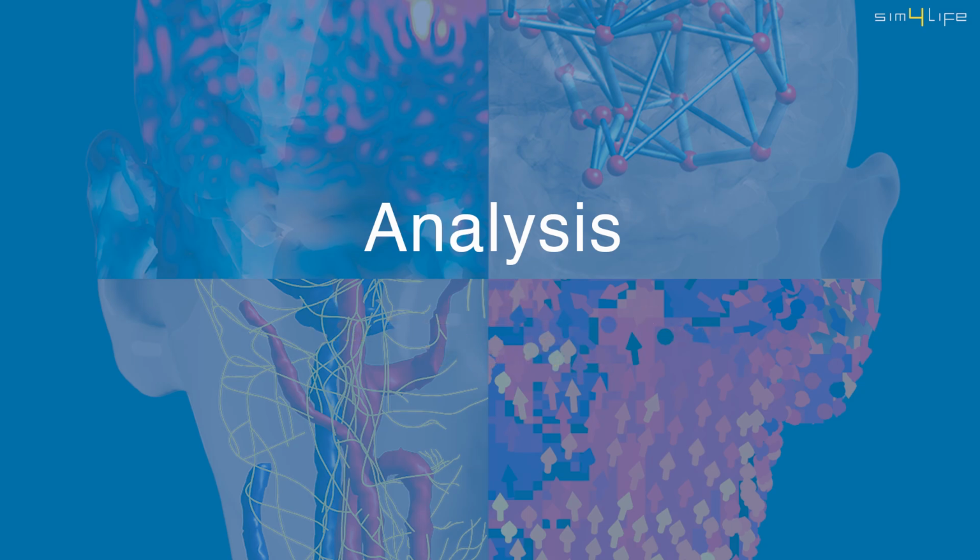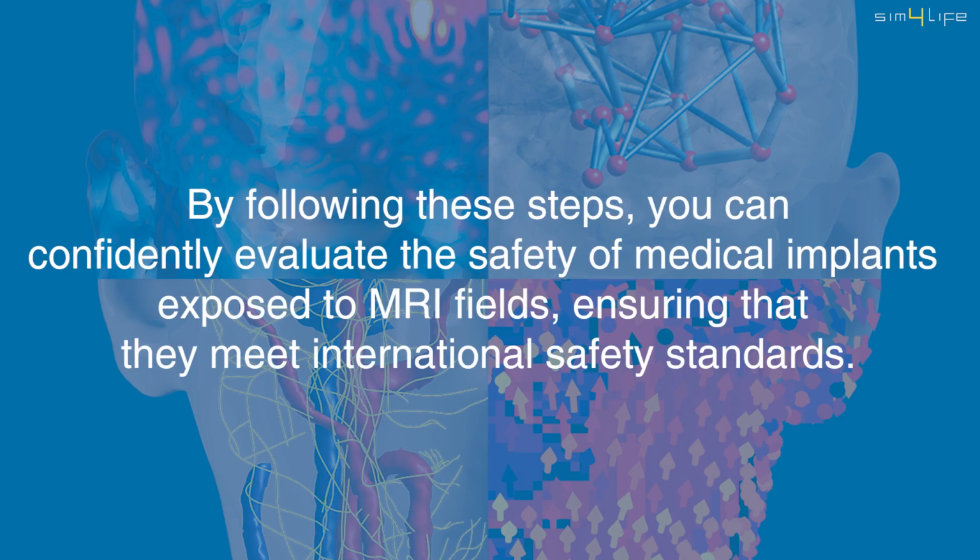Next, we move to the normalization based on the 1 microtesla value of B1+ peak. Again, we scale the PSIM as before. By following these steps, you can confidently evaluate the safety of medical implants exposed to MRI fields, ensuring that they meet international safety standards.